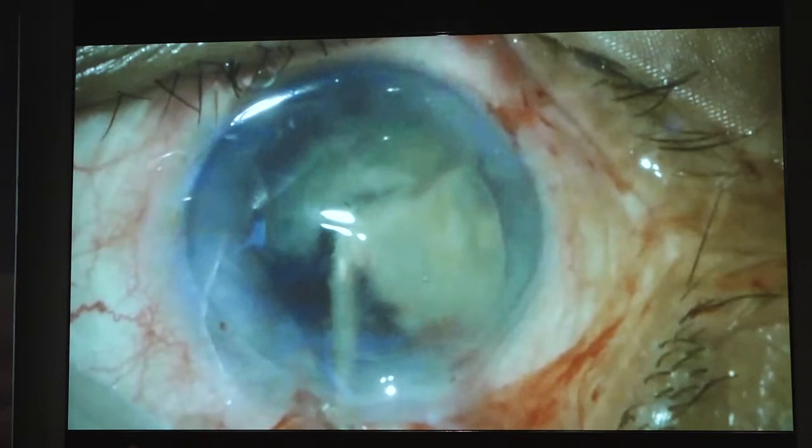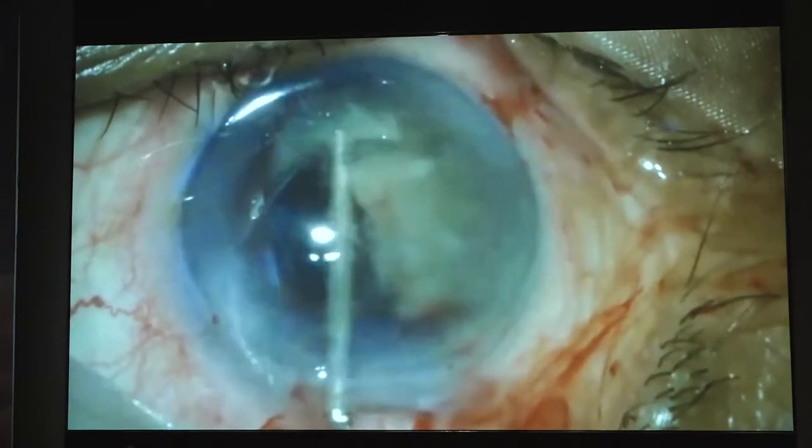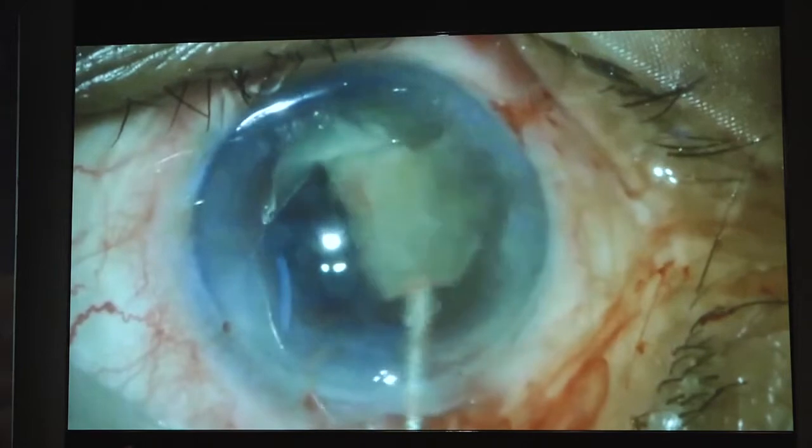It will break into two without any problem. You have to inject lots of visco in this case, and you will be successful. I have done just one maneuver of this kind, and you can see there are 3 pieces, and we can then remove this with visco.